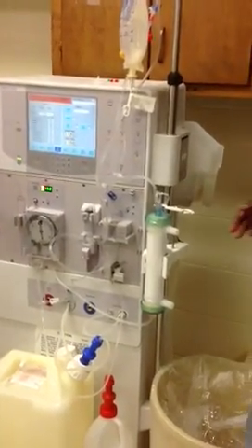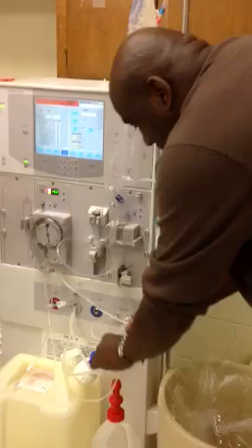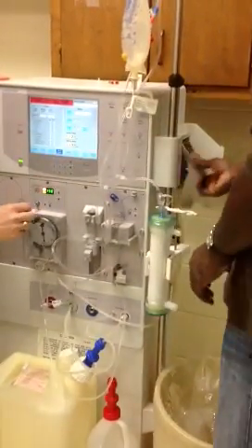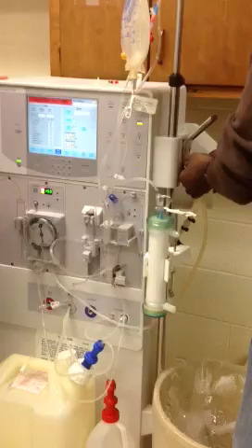We're going into recirculation. So you take one at a time, take those off, and open that door. And slide the silver part back on the blue one.